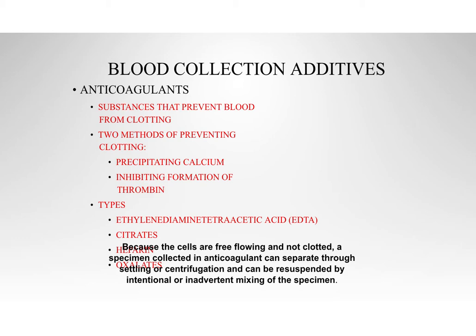Now, where it says types, you have EDTA. We're not saying that word. I'm not even going to try. Citrates, heparins, and oxalates, okay? Here, I'll write those out for you. So you have heparin. These are the ones that you can't see. Oxalates.